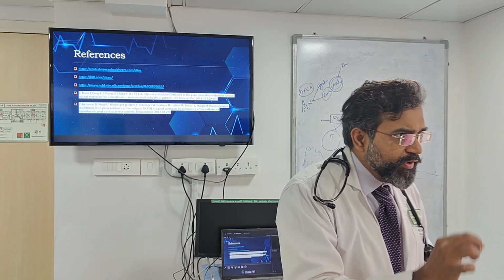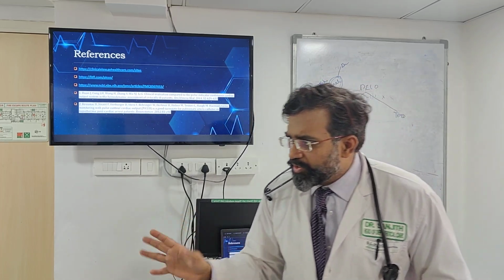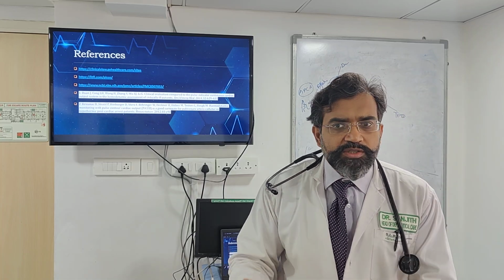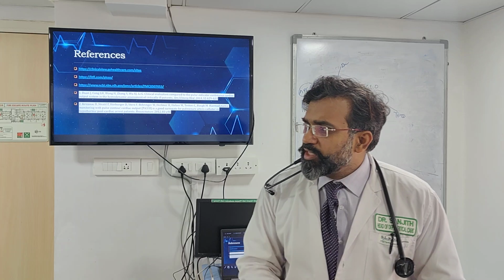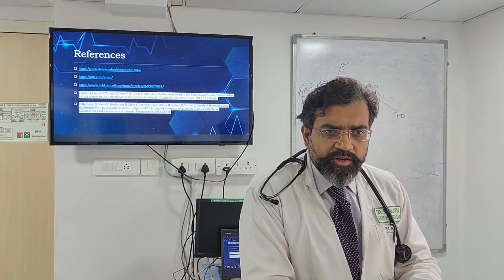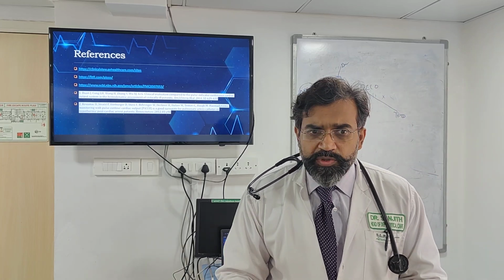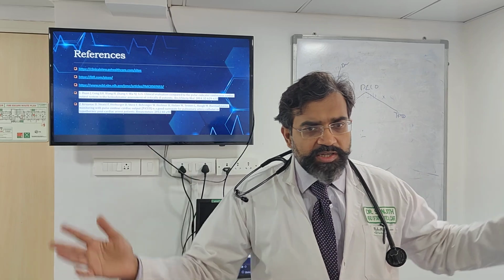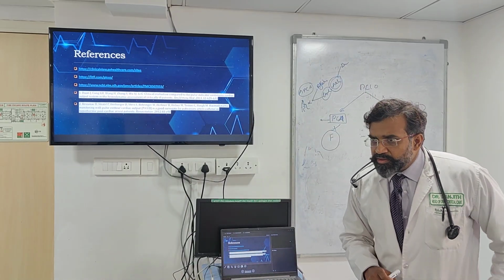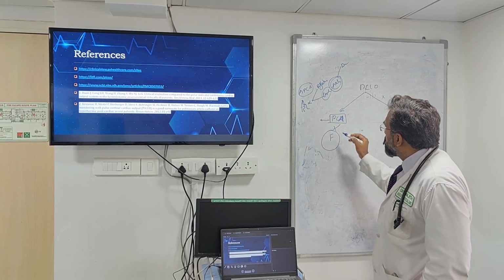That's why when you put your demographics, it calculates the computation constant. Okay, it's not measuring all these things. It is just telling you, okay, with this gender, this weight, and this height, this may be the aortic compliance. And since this is the aortic compliance, what you're seeing as a cardiac output is really not measured directly. It's multiplied with the computation constant, which is derived from large scale studies of volunteers of different sizes. Am I clear on that? The algorithm is not so simple. There's a lot of things to it, but this is partly.